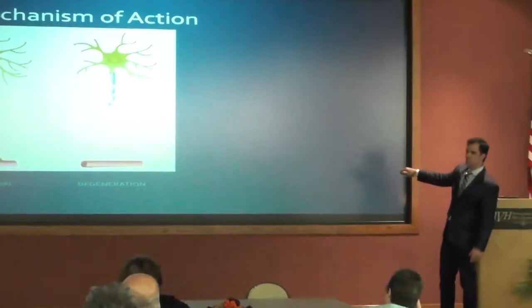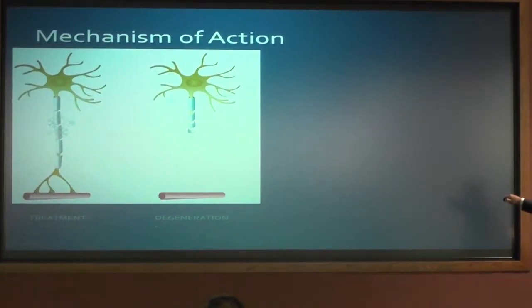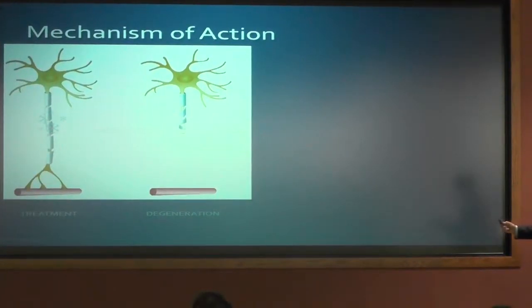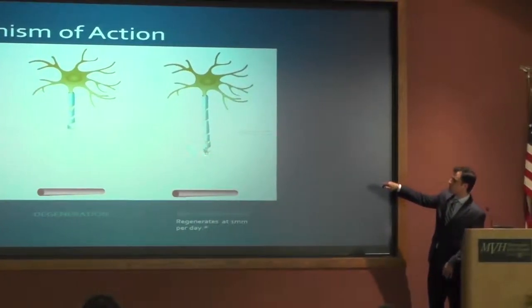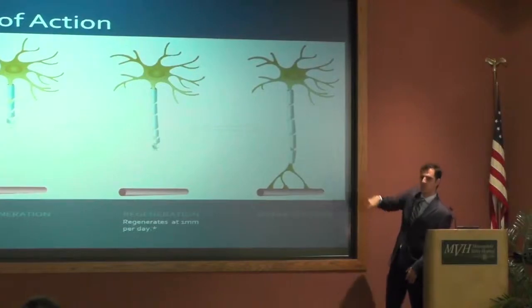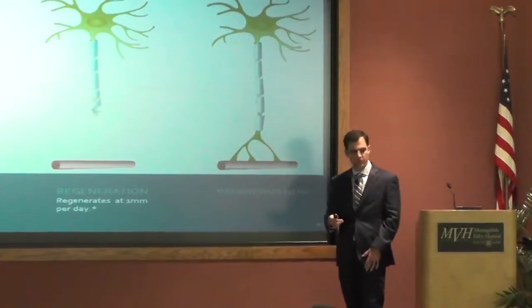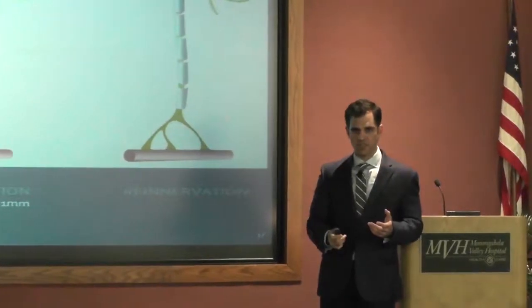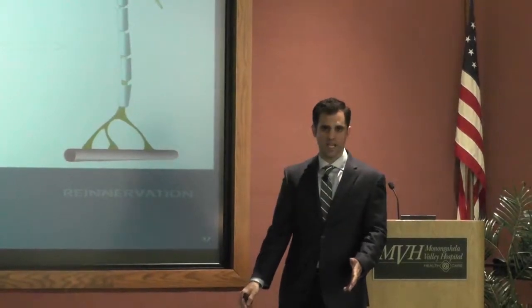That's what happens. This picture is not the best because you still have the connective tissue framework going all the way down here. All that's disrupted is that axon, the base unit of the nerve. Okay? The nerve regrows back at about 1 millimeter per day. That's what's shown here. Eventually making its way right back here and looking exactly like how it was at the beginning. So this is that reversible injury, meaning a non-permanent injury to the nerve. And these nerves that are treated only provide sensation to the knee. They have nothing to do with movement of the knee or anything else in the leg. It's just sensation.